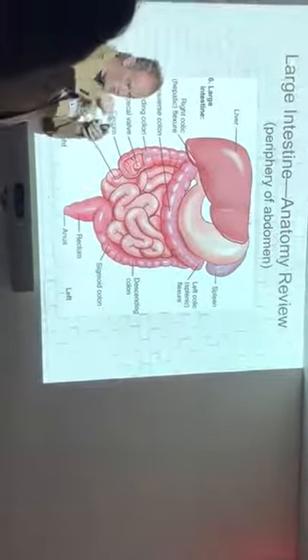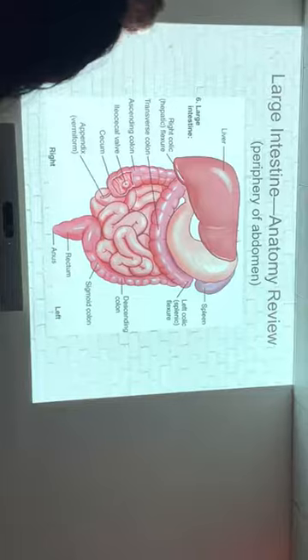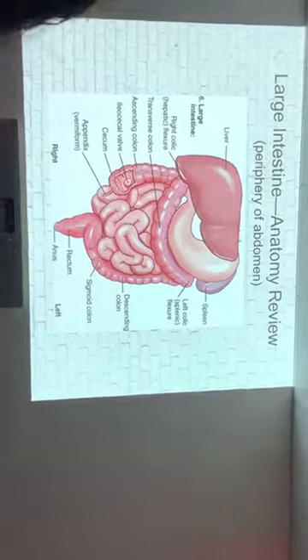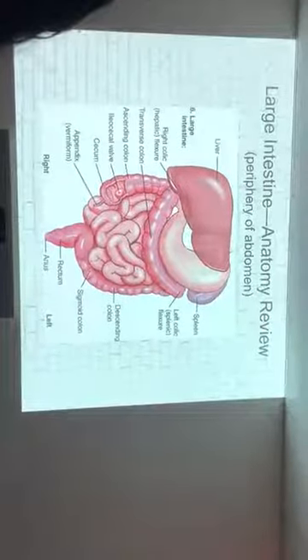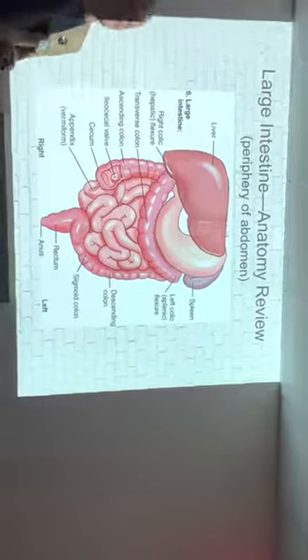On the little tip, there's a little raised line on it, and if you go past that, you're in danger of hurting the patient. You don't want to go beyond that. You got to be careful because anyone ever done suppositories before? We're getting a little personal here, but what's the colon do? It suctions. So you got to be careful because they will suction up that tip as well. So you don't want to go too far.